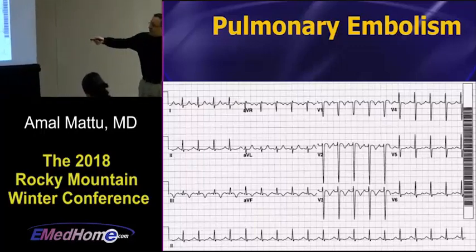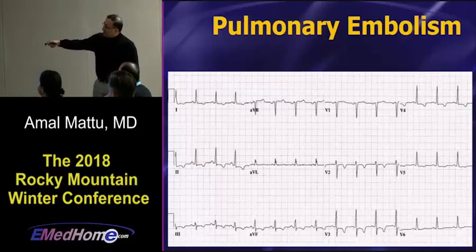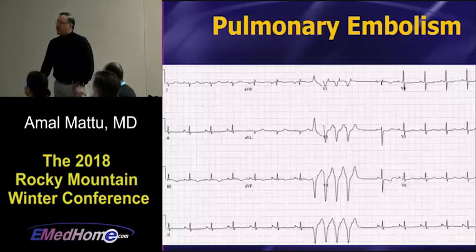Take a look. T-wave inversions in the inferior and anteroseptal leads, enormously likely to be PE.